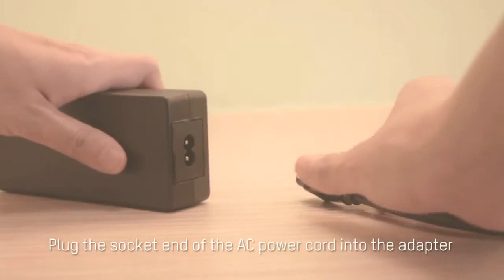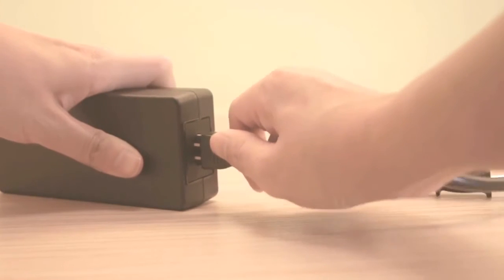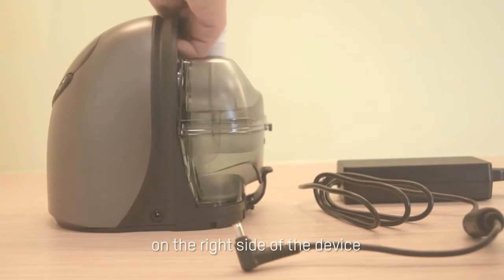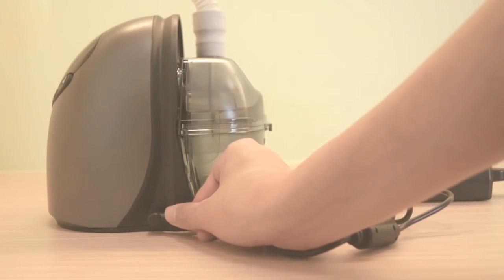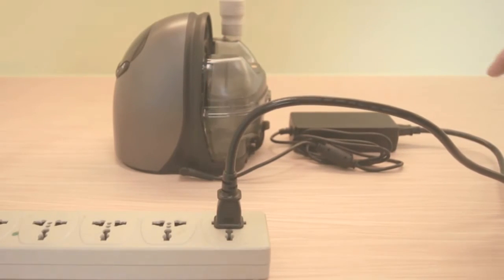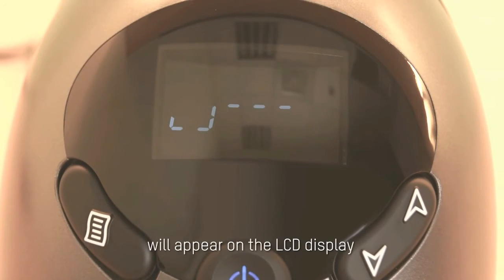Connecting the AC power. Plug the socket end of the AC power cord into the adapter. Then plug the power cord to the power inlet on the right side of the device. Plug the pronged end of the AC power cord into an electrical outlet. The CPAP system is now ready to operate and Stand By will appear on the LCD display.